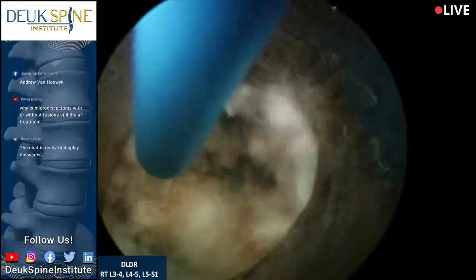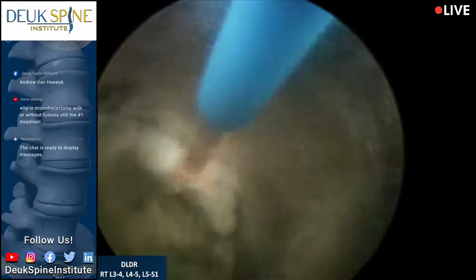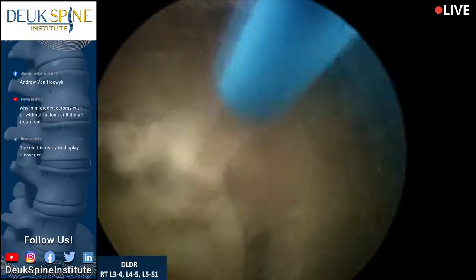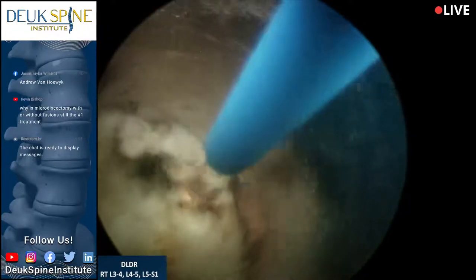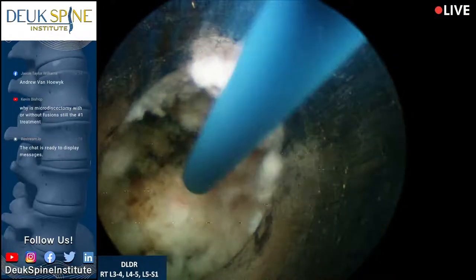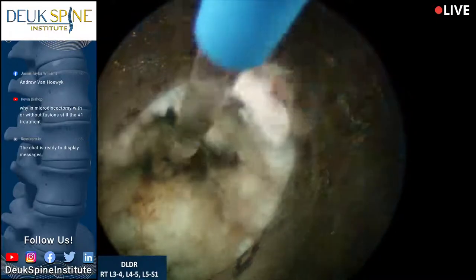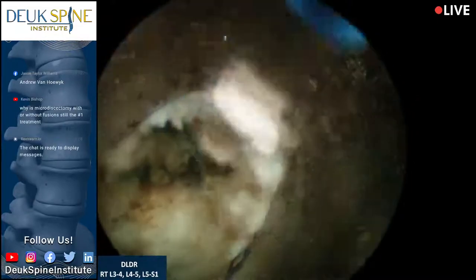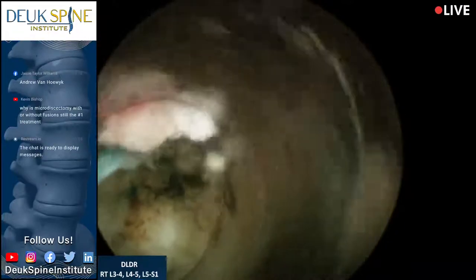We're almost done here at L4-5, and then we're going to move over to L3-4. Just one thing to notice here, it's kind of interesting, just near the laser tip is actually normal nucleus. See this right here? That is normal nucleus pulposus. Notice it didn't stain blue. The degenerated nucleus material stains blue. So we're going to leave the normal nucleus there.